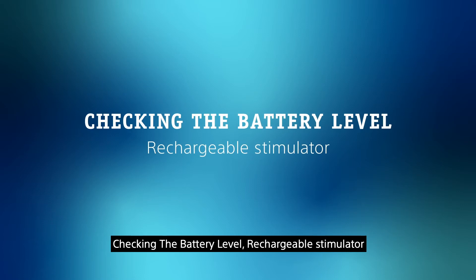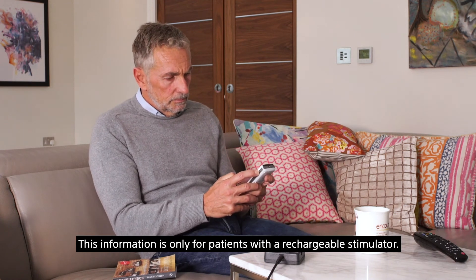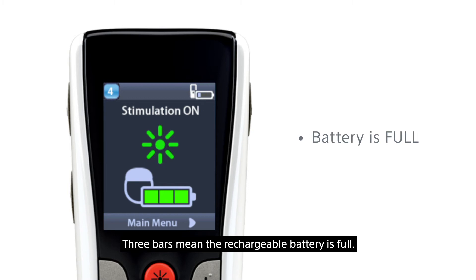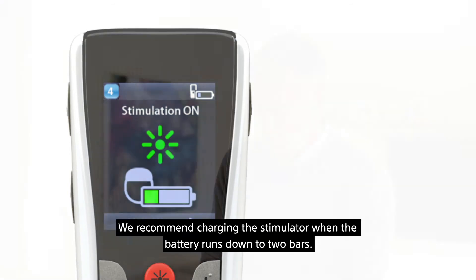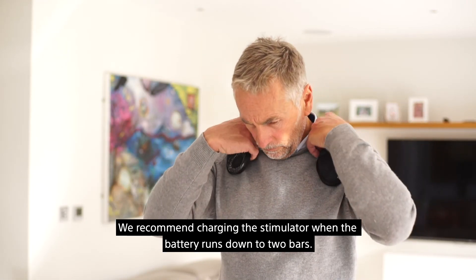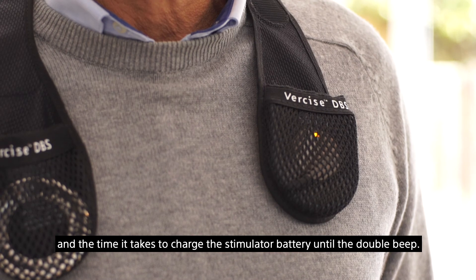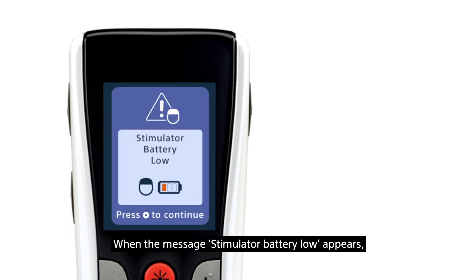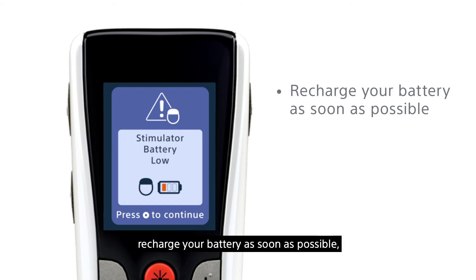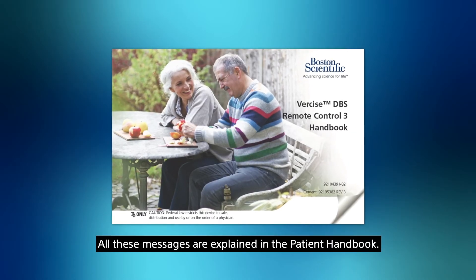This information is only for patients with a rechargeable stimulator. Three bars mean the rechargeable battery is full; two bars mean the battery is okay; one bar means the battery needs to be charged. We recommend charging the stimulator when the battery runs down to two bars — this gives a good balance between charging interval and the time it takes to charge the stimulator battery until the double beep. When the message 'stimulator battery low' appears, recharge your battery as soon as possible; otherwise your stimulator will switch off and you will lose the effects of stimulation until the battery is recharged. All these messages are explained in the patient handbook.